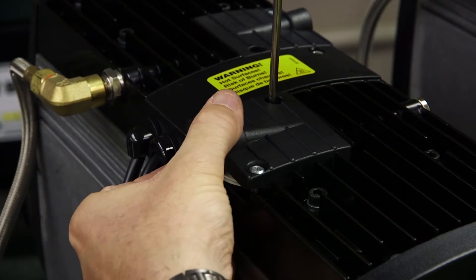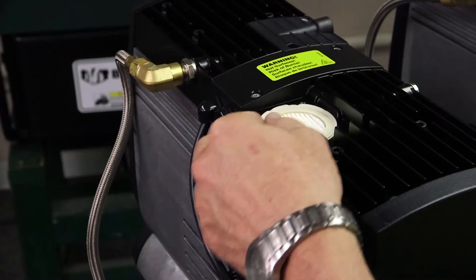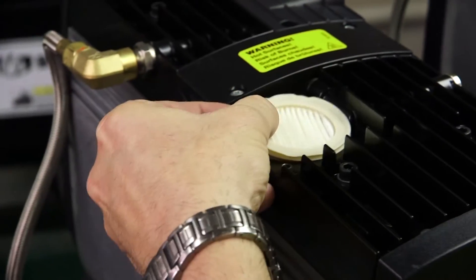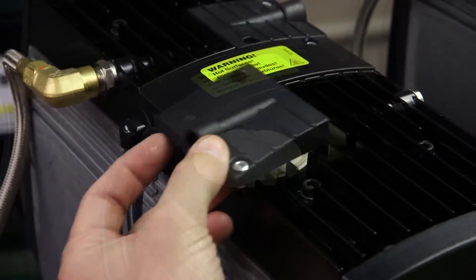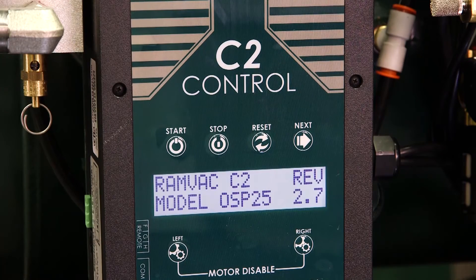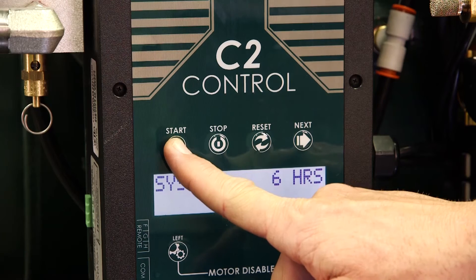Third, remove the intake filter cap by removing two screws. Fourth, remove the intake filter and discard. Next, install the replacement filter and replace the filter cap. The sixth step is to plug in the compressor to return power. Last, return the compressor to service by pressing the start button.